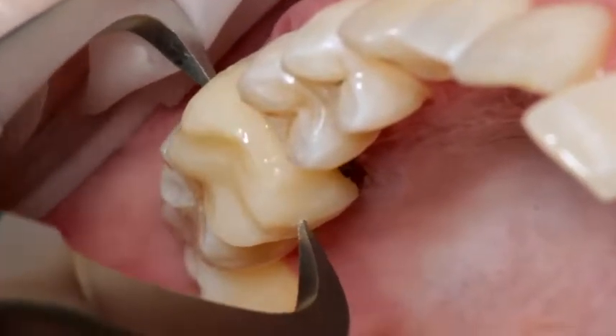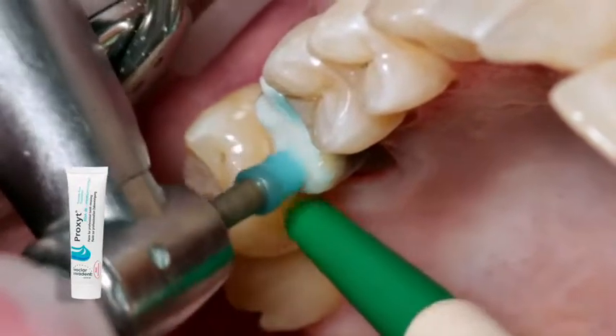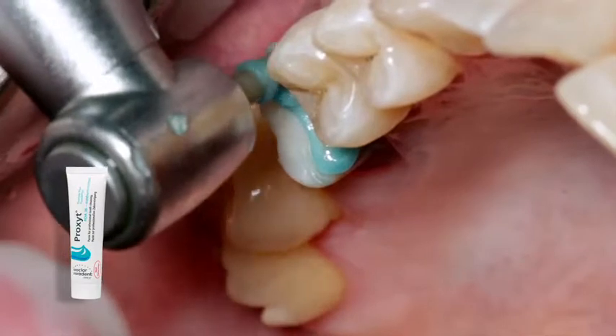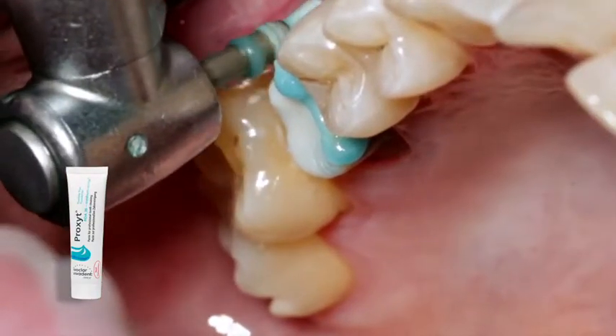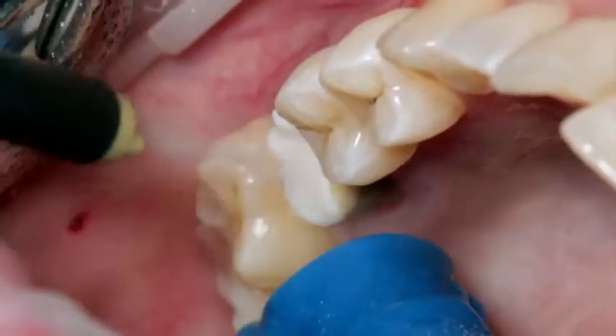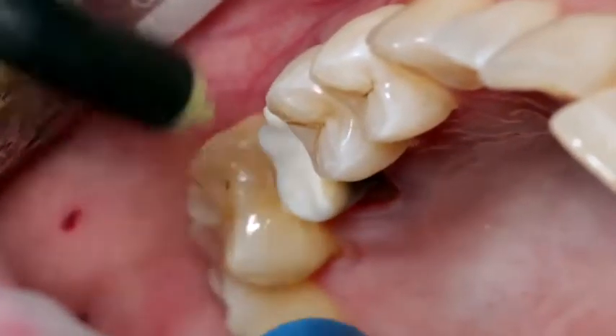Remove the temporary. If necessary, clean the preparation with a polishing brush and a fluoride-free cleaning paste, such as Proxite fluoride-free, in order to remove any leftover temporary cement. Subsequently, rinse the preparation with water spray and dry it with oil and moisture-free air.